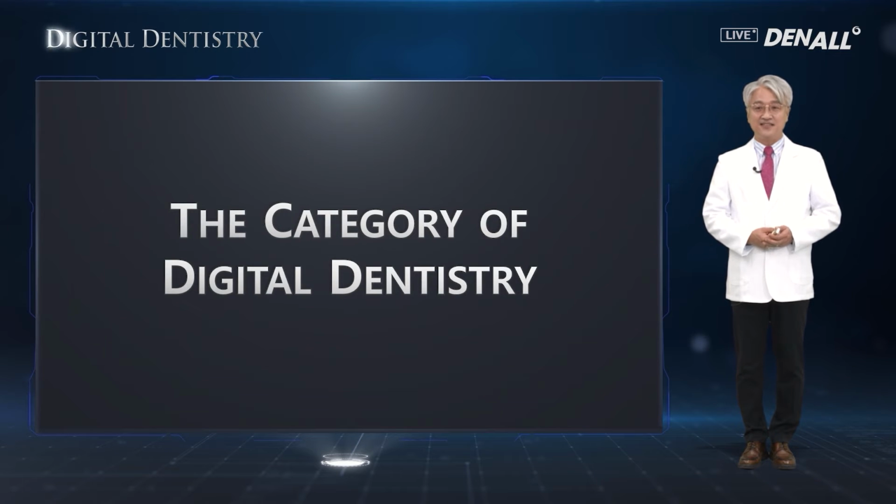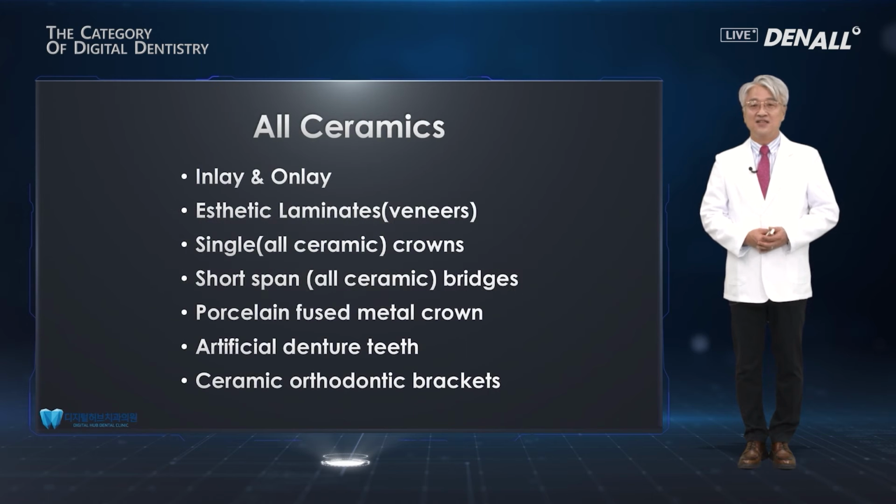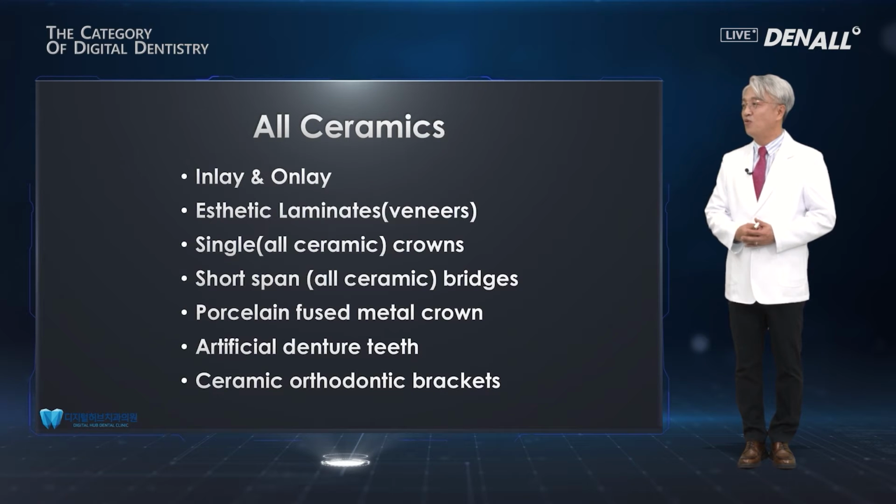Today I'm going to talk about the category of digital dentistry. So we will look at what are the areas you could use digital dentistry. When you say digital dentistry, it's about CAD/CAM, and CAD/CAM, of course, means all ceramics. So what can you do with the ceramics?